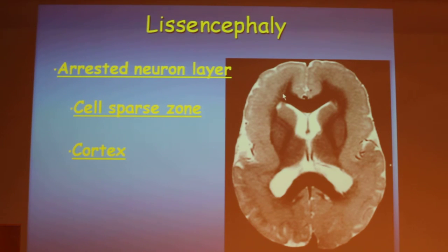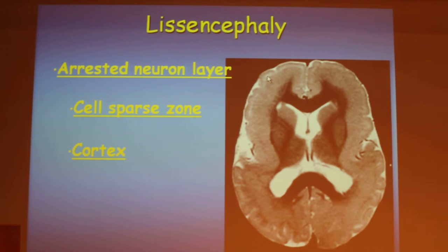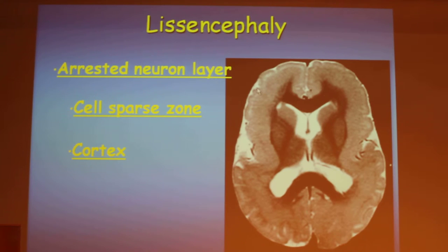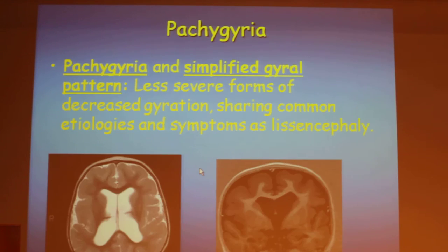If we look closely into the cortex, we see that there is an arrested neural layer which is very thick, and there is a very thin cell-sparse zone on T2 with high signal intensity, and then a thin cortex on top of it. This is the hallmark of lissencephaly, and we have to look at the whole image.